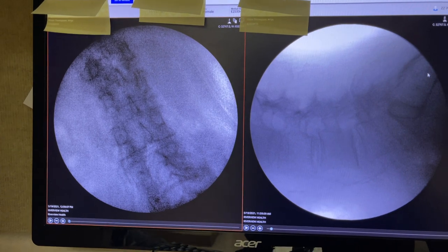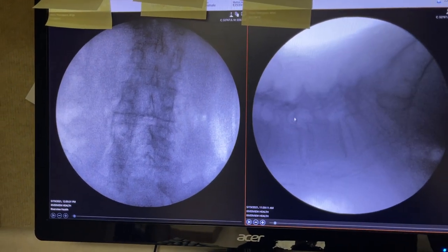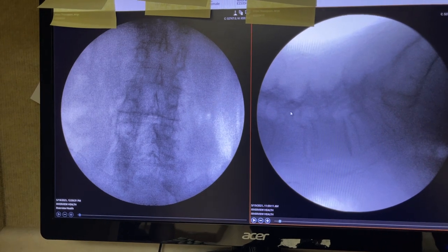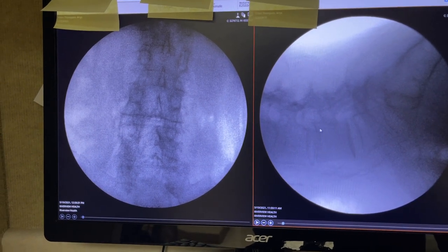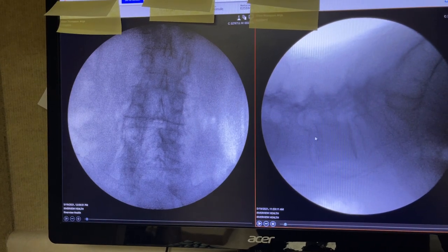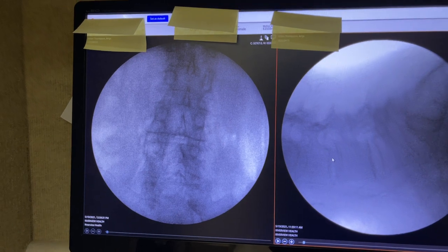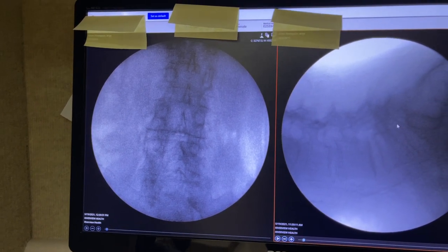These are the initial pictures for orienting ourselves. You see here there is a double shadow of the pedicle. The discs are not aligned — here they are aligned in the 4-5 but not in the 3-4, meaning the patient has a small scoliosis, and here we see that scoliosis as well.